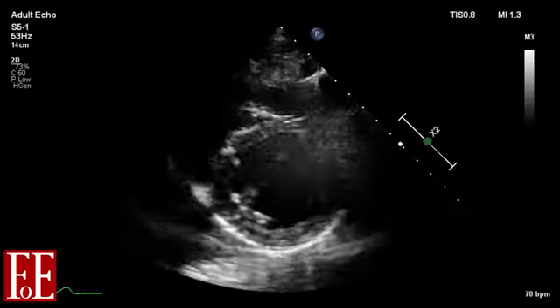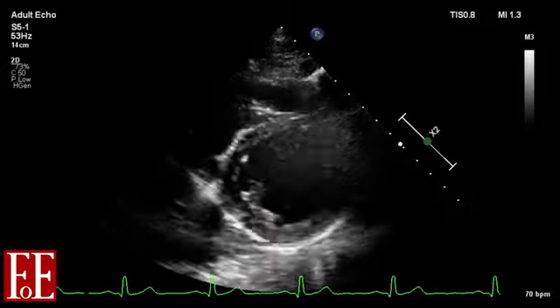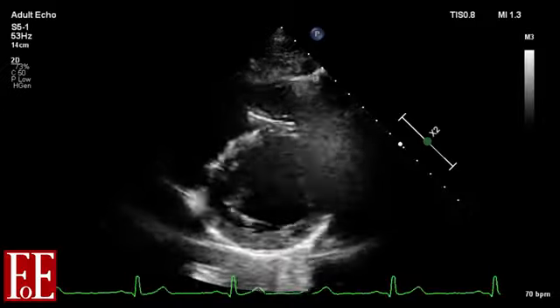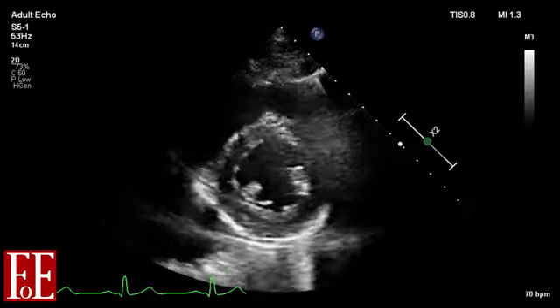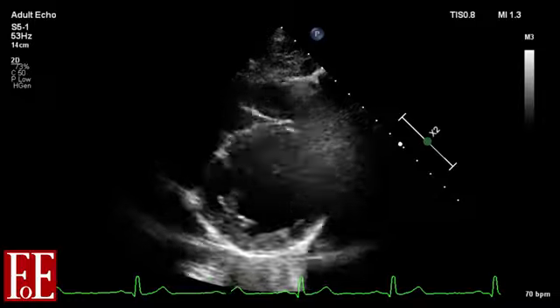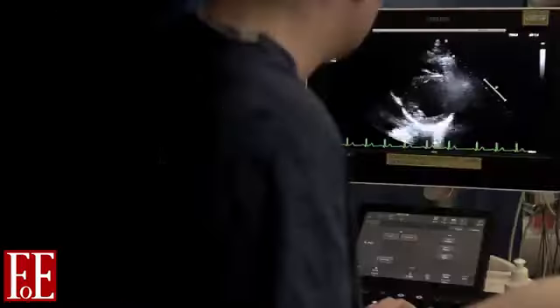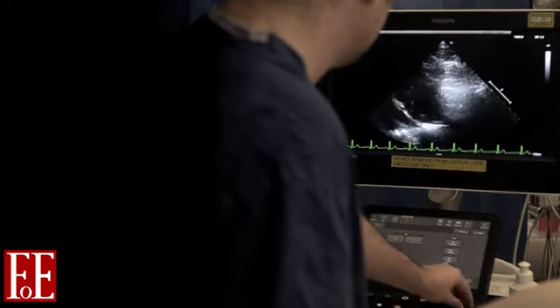Finally, we're going to take a look at the intraventricular septum. We're going to look for flattening of the intraventricular septum. We're looking for the septum being pushed away from the right ventricle in towards the centre of the left ventricle. And if that's occurring predominantly in diastole, then that's suggesting right ventricular volume overload. And if that's predominantly a systolic phenomenon, then that's suggesting pressure overload. Of course, the two frequently coincide.